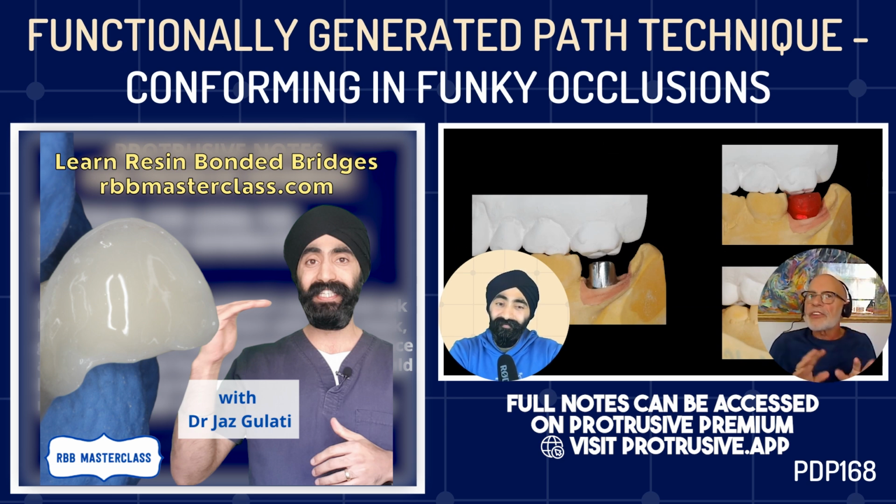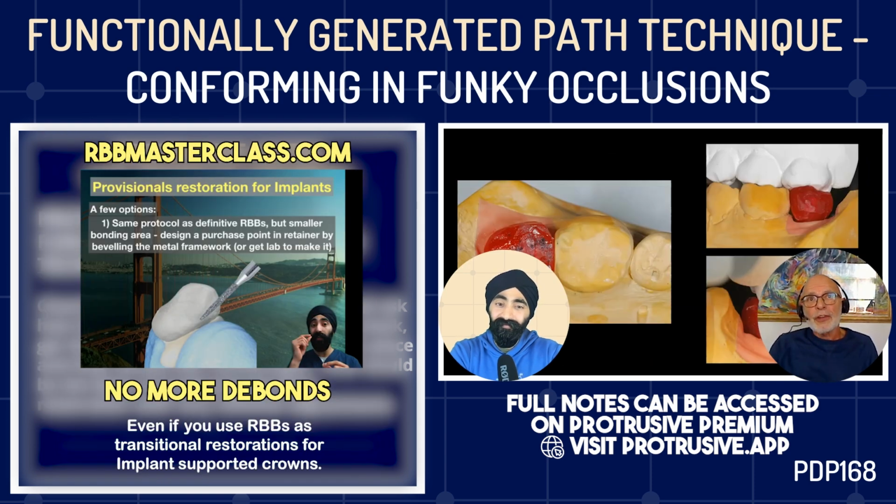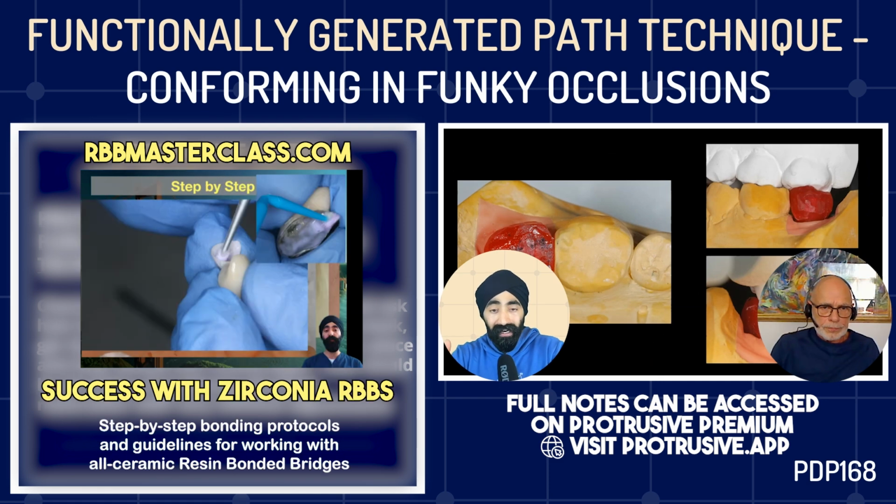They go, yeah. Anything catching? No. And that is basically the basis of producing the final restoration without having to make anything other than minor adjustments. Amazing. So it's capturing the function and sending this little custom functionally generated piece of Duralay back to the lab to recreate.